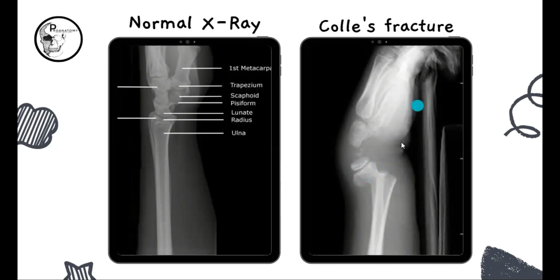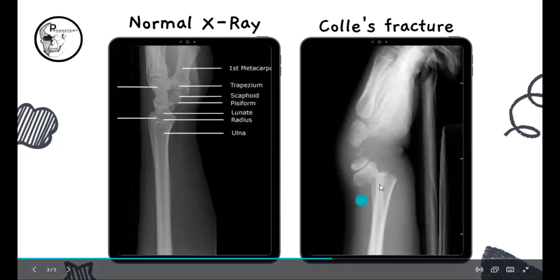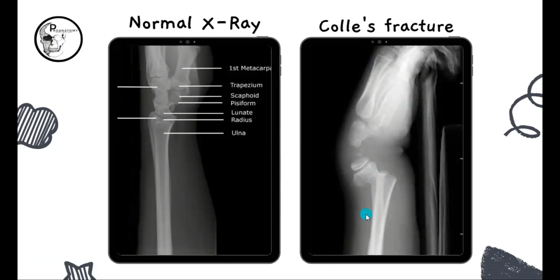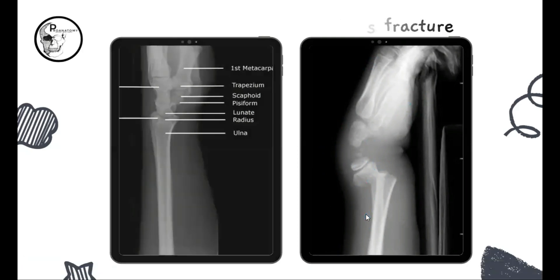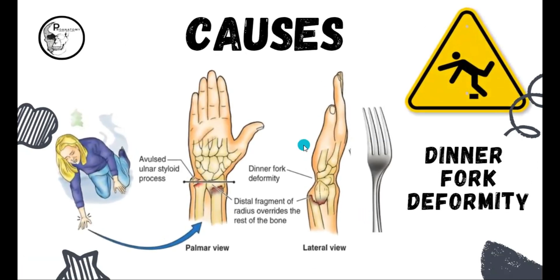Here the backward displacement of the fragment of the distal end fracture is termed as the Colles fracture. Here you can see the palmar aspect and this is the dorsum of the hand. And you can see the straight line of the soft tissue has changed into a curve here, and it almost aligns with that of a dinner fork, and hence it is called as a dinner fork deformity. So let's see what are the causes of the Colles fracture.